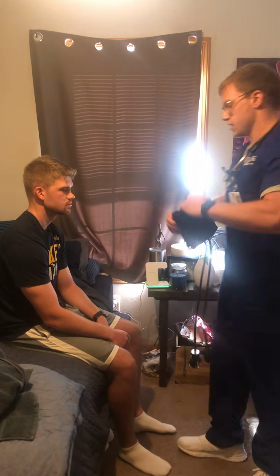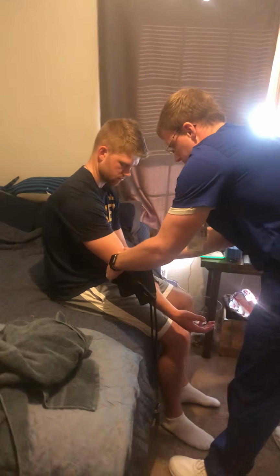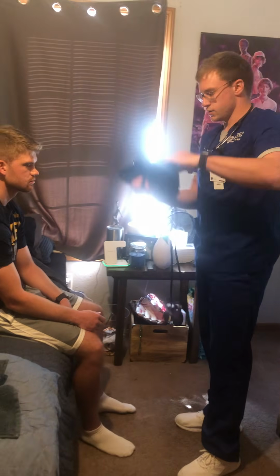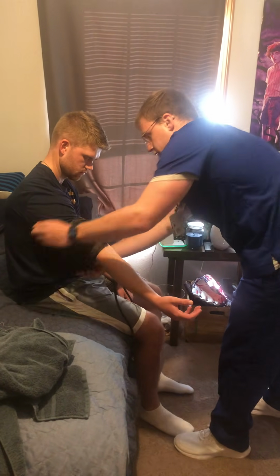So I'm going to go ahead and first locate the artery. This is the brachial artery, and once I have that located, I am going to go ahead and place the blood pressure cuff 1 to 2 inches above where I found the artery.